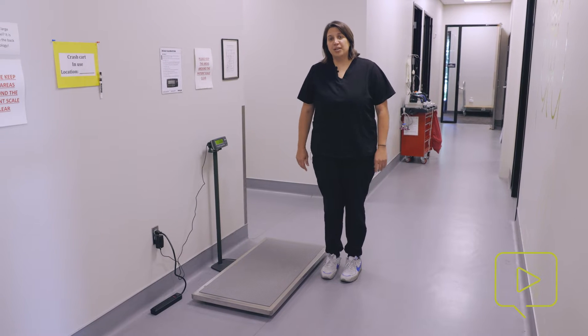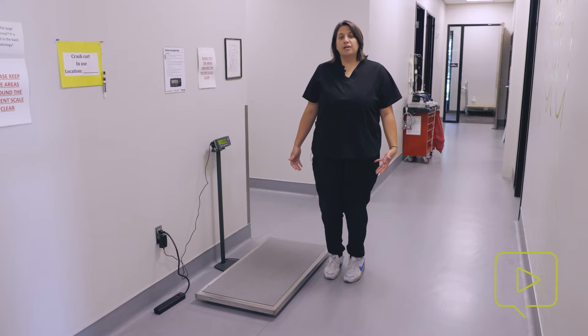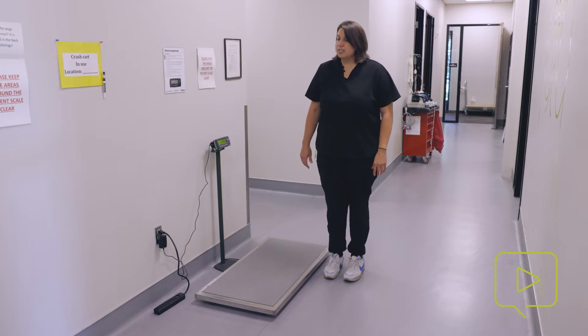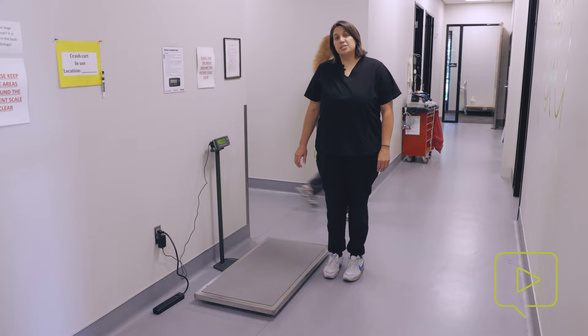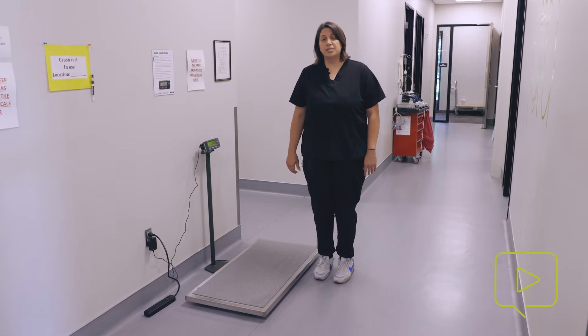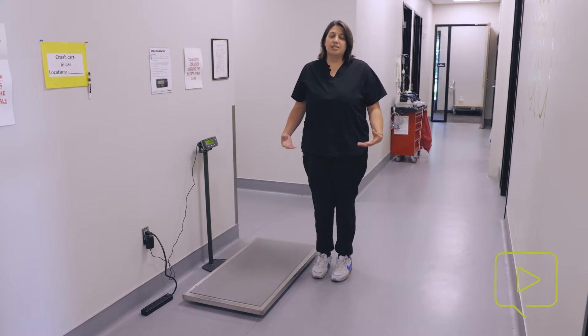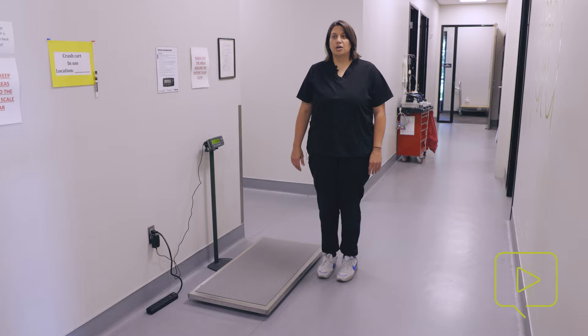Hi, my name is Sarah, and I'm going to talk to you today about getting weights on patients. In veterinary medicine, it's really important to have accurate weight on any patient that comes into your hospital. Oftentimes, we're using their weight to track weight loss that we're trying to help clients and pets achieve, or weight gains after a critical illness or a growing animal.